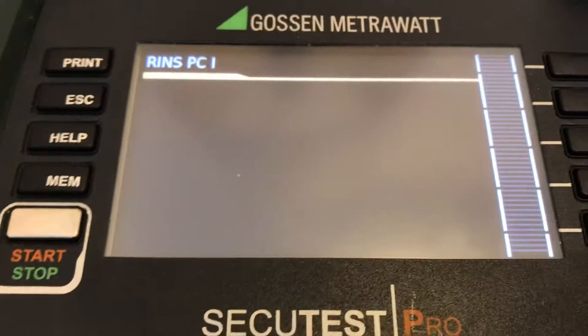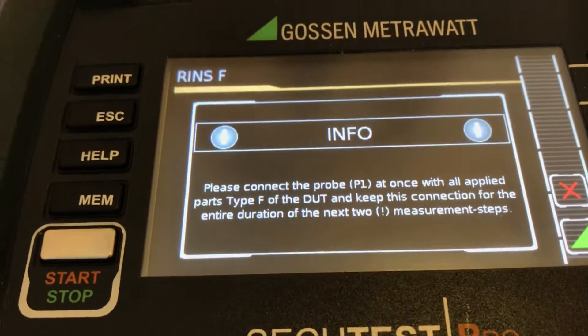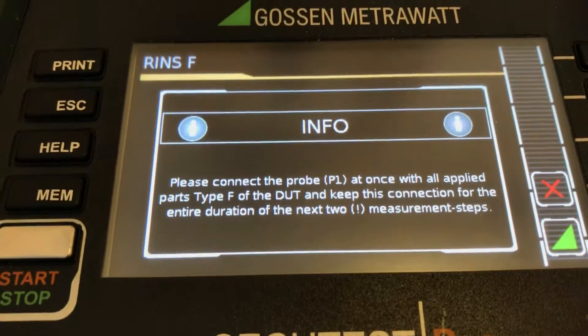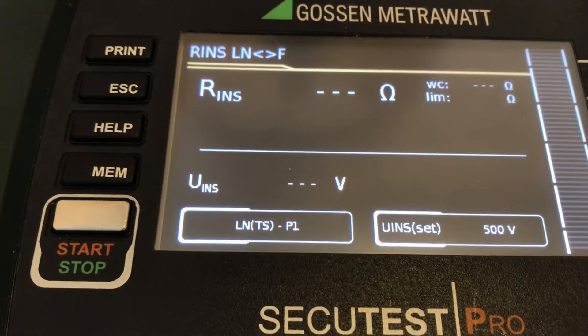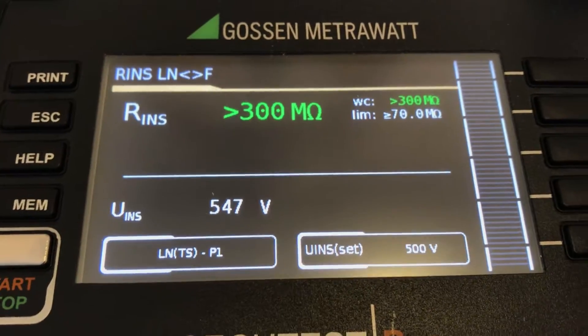Now we are performing the insulation resistance measurement, which runs automatically. It indicates that we need to connect probe P1 to the Type F connector from the measurement side for the applied parts.